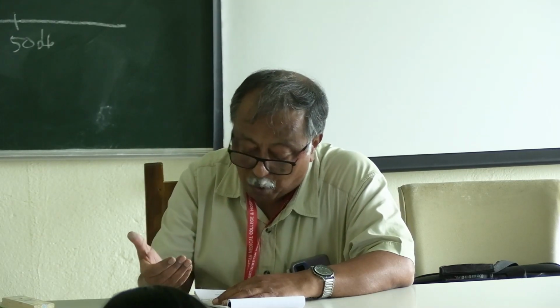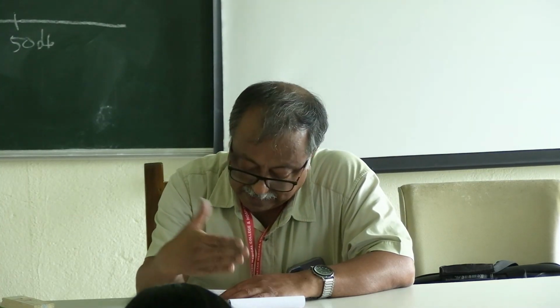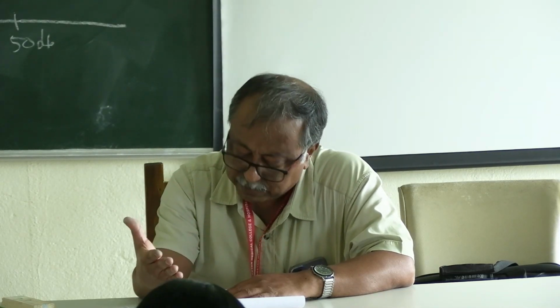1 decibel increment is given each 5 seconds. And then the patient is asked to give the response. If the 20 such beeps are delivered, the score will be assessed by the percentage. That means 20 decibel above the threshold, always in the defective and the normal ear. Every 5 seconds there is a 1 decibel rise.